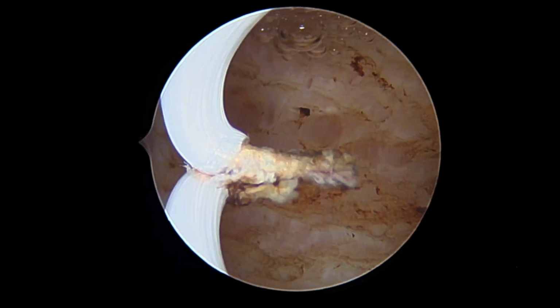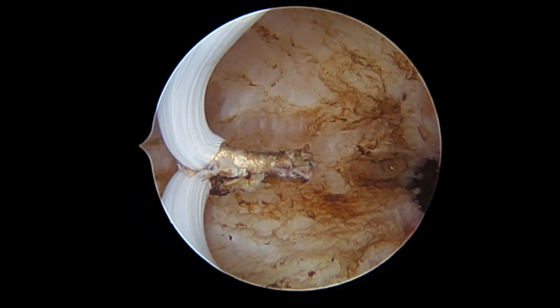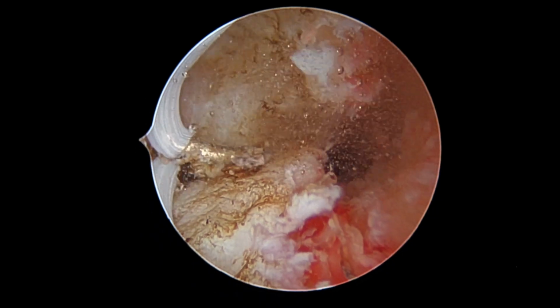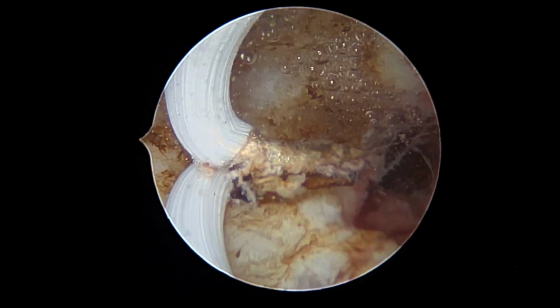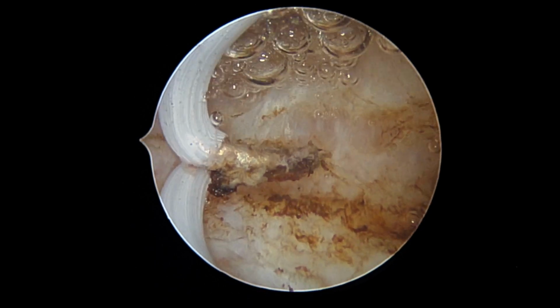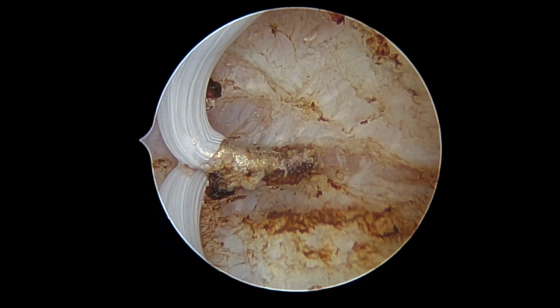As demonstrated, the monopolar diathermy tip is placed at 90 degrees to the septum. The resection is performed gently and gradually from the midpoint of the septum. It is important to ensure the tip of the diathermy is always in view and in control.